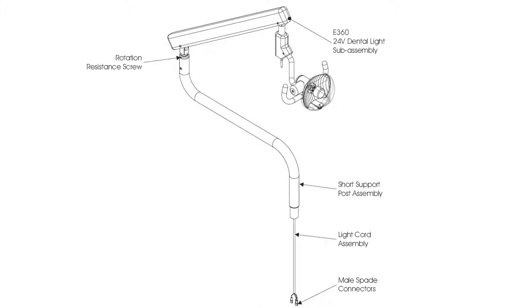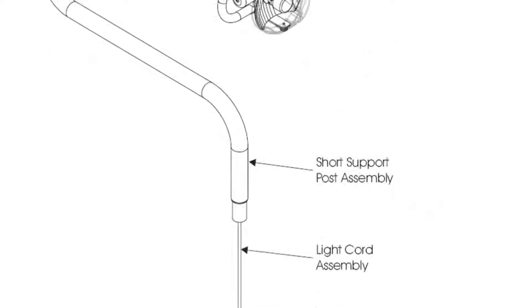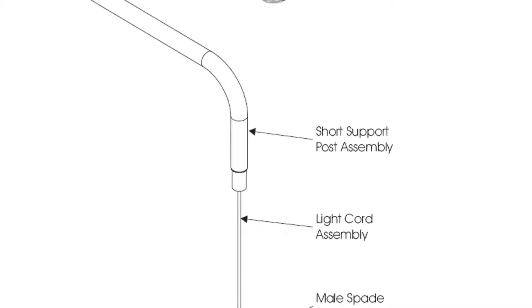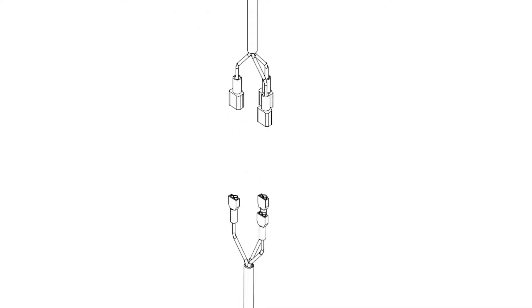For E360 packages, lift the flex arm from the support post to locate the break in the light wiring harness. Disconnect the light wiring harness by pulling the 3 mated spade connectors away from each other.